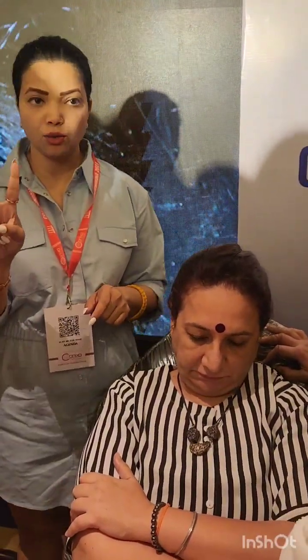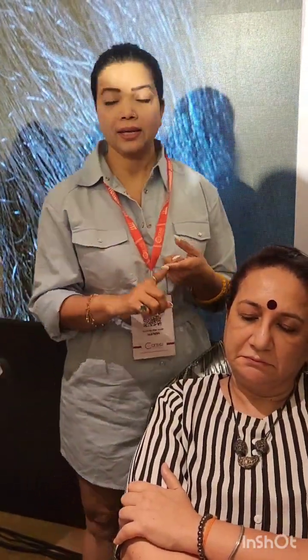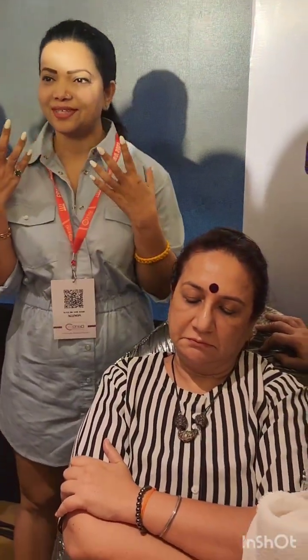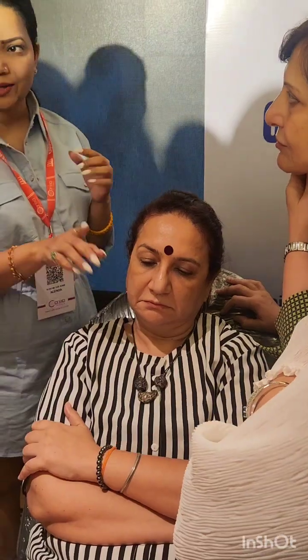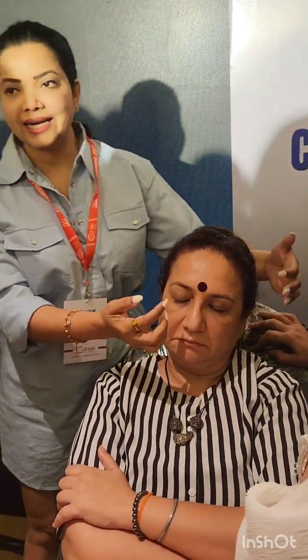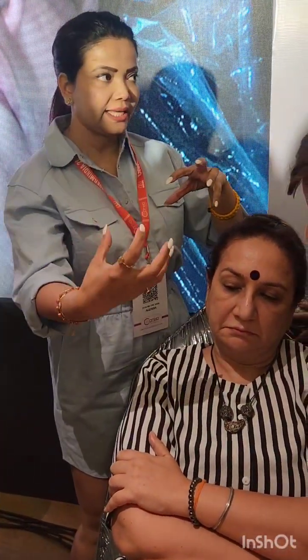So there are two markers if you are going deep. One is that you won't be able to lift your needle, and the second will be the patient will start wincing. Patient will wince when you approach the end point, the zone of action. Why? Because there the nerve innervation is superficial. So that's the sign why you should not advance further. Now you should not cross the crease also. If you are not doing silhouette, you can cross with silhouette because the cones are made like that.